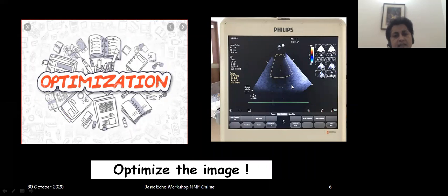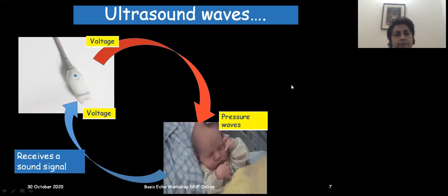To understand our images, we need to optimize them well. So the basic idea of this presentation is to know how to optimize our ultrasound images well. So first we need to understand what is an ultrasound.